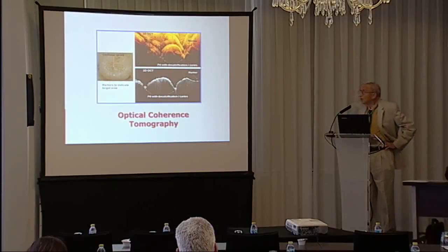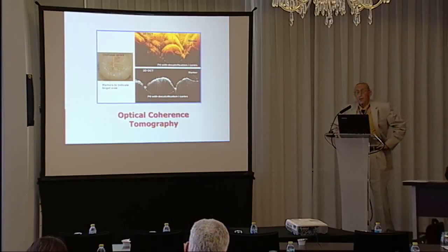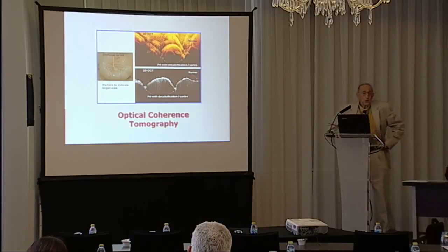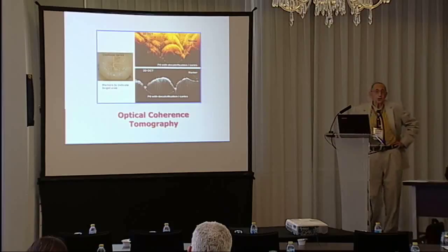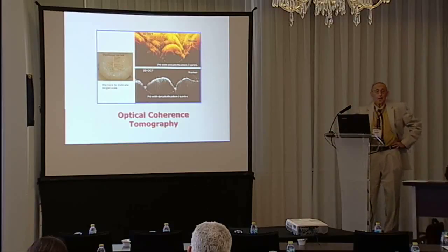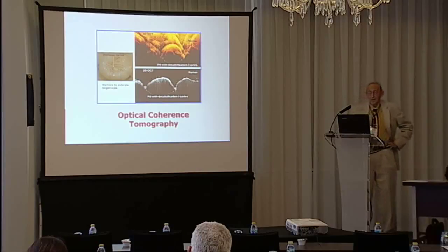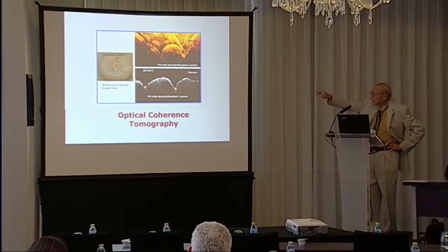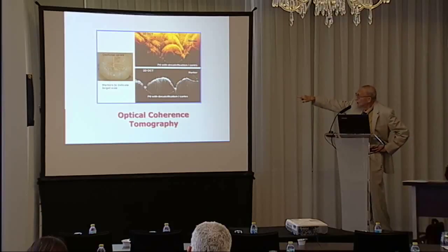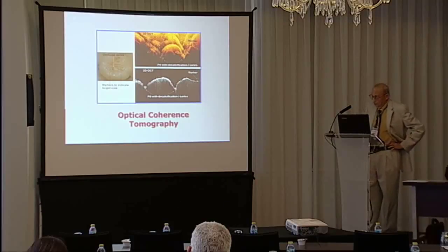With your OCT, what you can do is get images of the occlusal surface. You can detect occlusal caries on there. There's 2D OCT and 3D OCT. And you've got markers on here to indicate the caries, and you can see it on the 2D with the pit with the decalcification, and 3D with the pit with the decalcification.